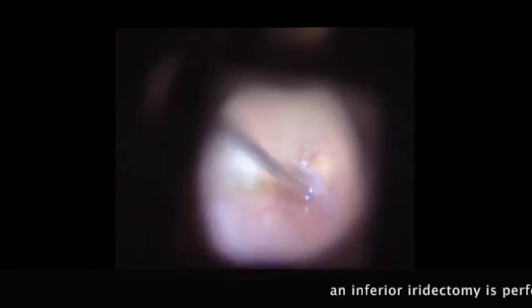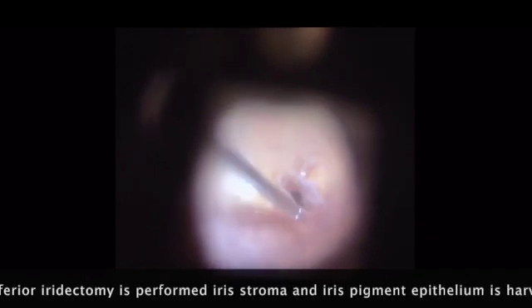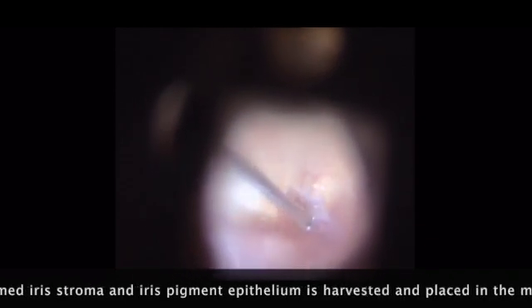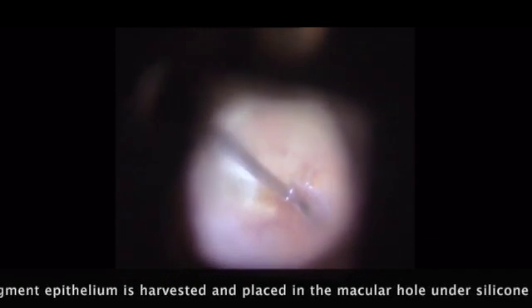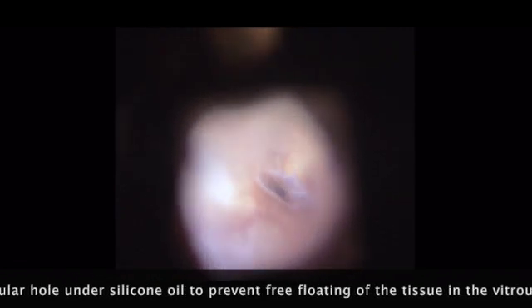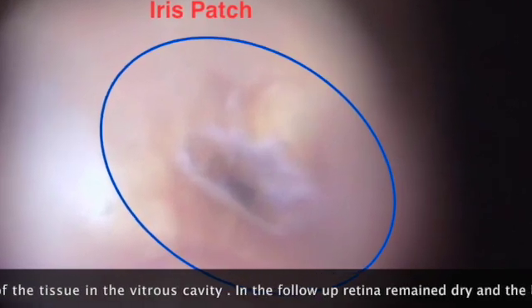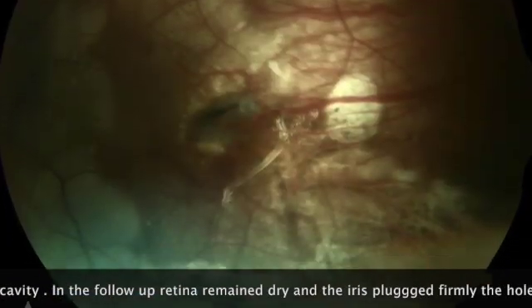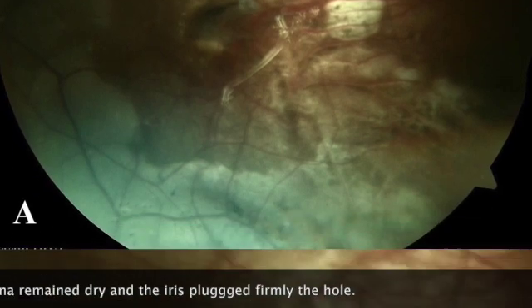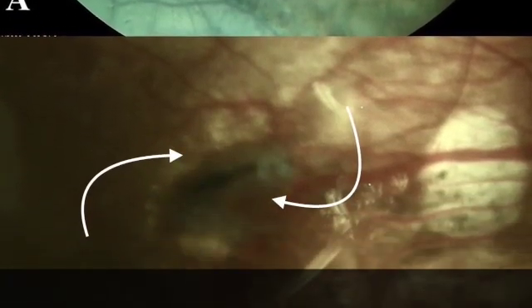An inferior iridectomy is performed, and iris stroma and iris pigment epithelium are harvested and placed in the macular hole under silicone oil to prevent free floating of the tissue in the vitreous cavity. In the follow-up, the retina remained dry and the iris plugged the hole firmly.